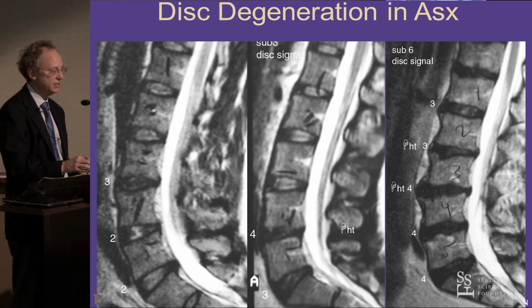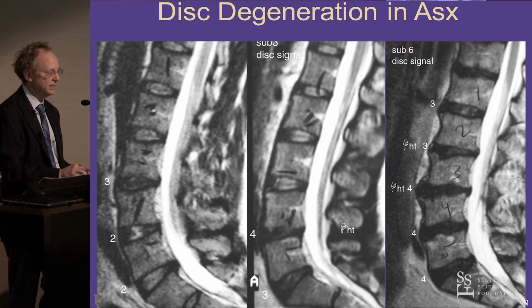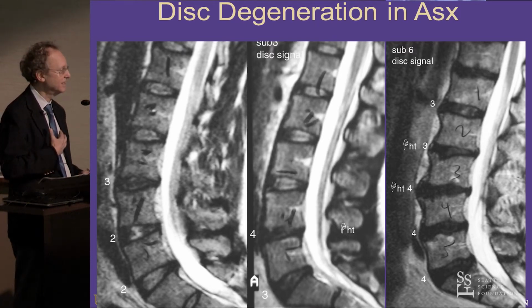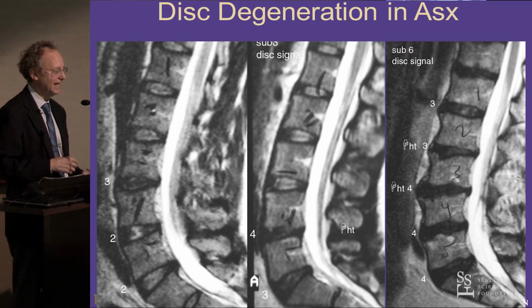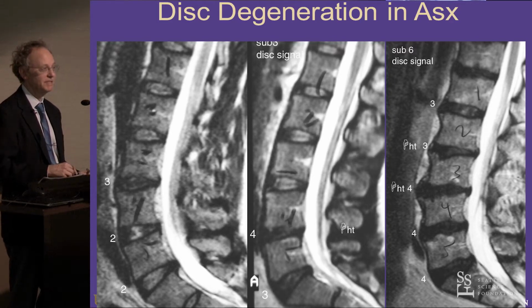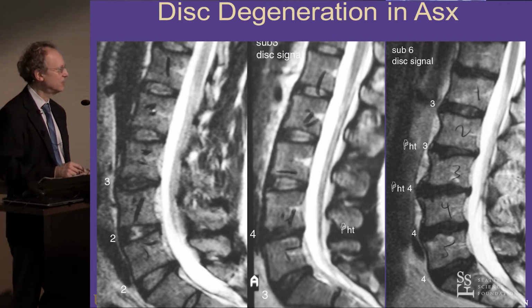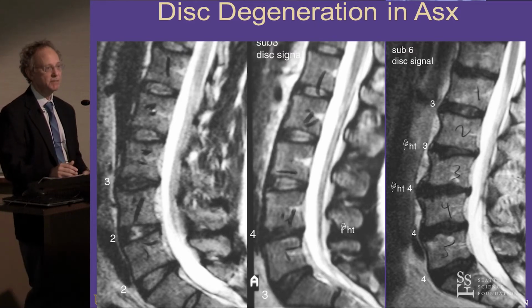And here's just an example from a study that we did at the VA here a while ago now, probably 20 years ago. We call this the LAID BACK study. It's probably my proudest accomplishment as an academic, coming up with that acronym. It was Longitudinal Assessment of Imaging and Disability of the Back. So it's actually relevant. And so these are 3 different asymptomatic patients.